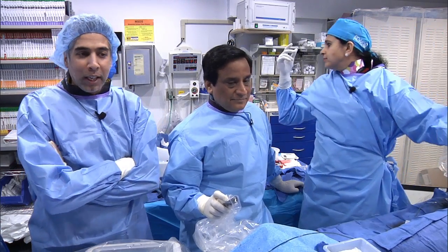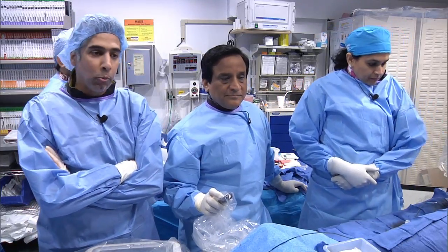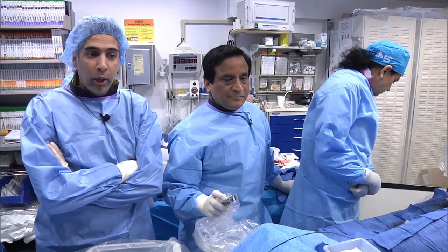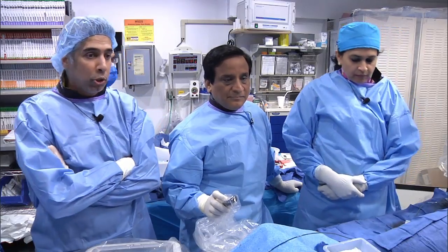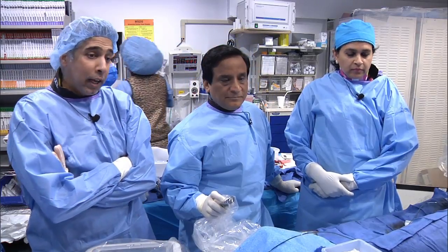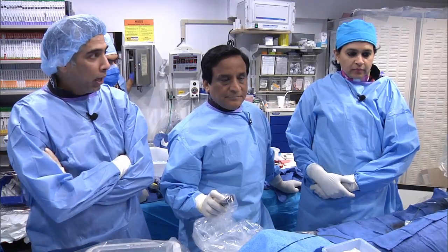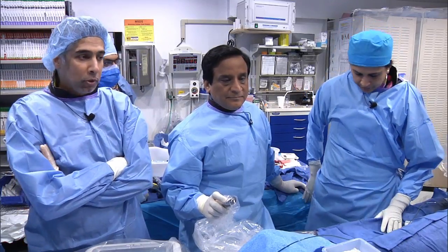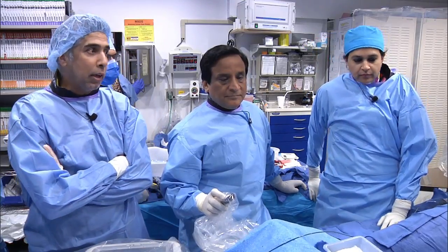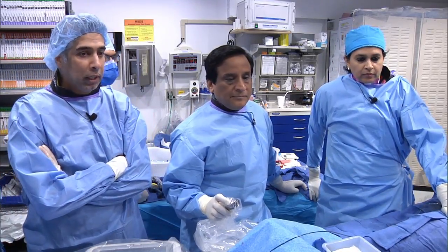I really use the same catheters irrespective of that, although we definitely understand there's often more tortuosity in the subclavian that can be more challenging. There are several centers that, if patients are older than 75, or also we didn't mention short stature, would default to a left radial first approach. The catheter I use generally from the right, we will downsize our catheters, and we like the VL catheters here, as you probably have noticed in prior cases. It's a softer tip, and it's more for me about the technique of engaging and folding the catheter in the ascending aorta and using a wire to unfold it into the left sinus and then the left main.